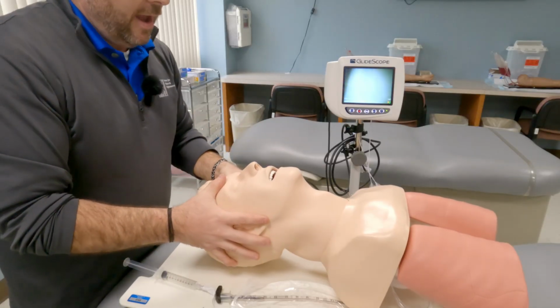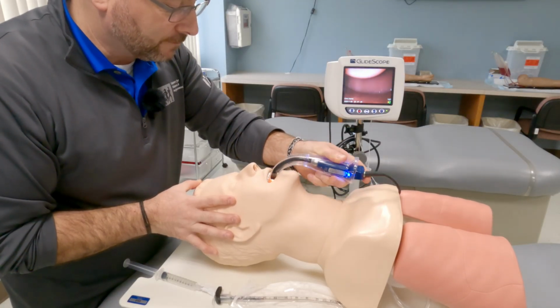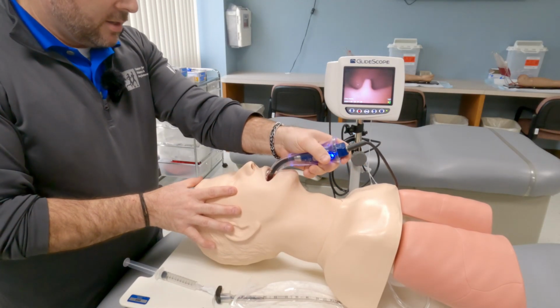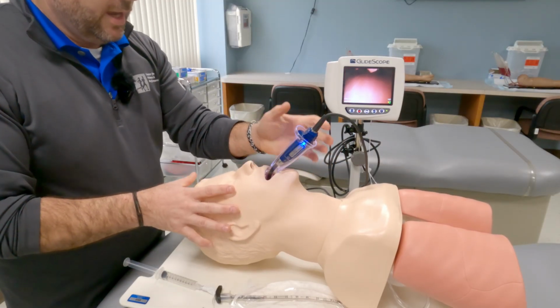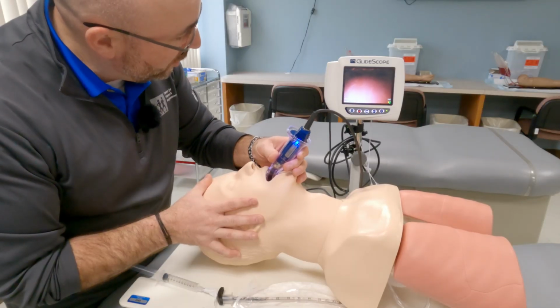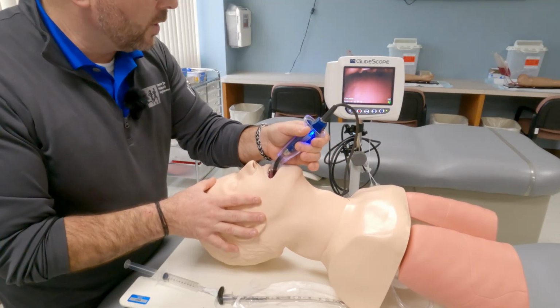So I'm going to have the patient prepared, left hand obviously gloved. I'm going to go straight down the center. You may have to get around a sticky tongue here or there. So I'm going straight down, and you notice I'm going to go straight down and around the corner to about here. So it kind of goes around the corner, and now I'm in the oropharynx. You can see it on the monitor, not seeing a whole lot. If you look down low down there, that's way into the dark. That's the esophagus.